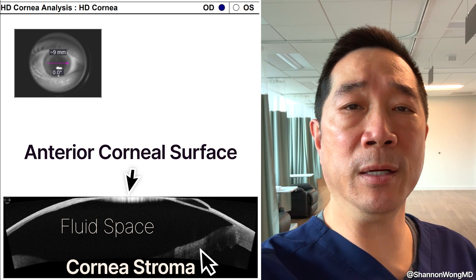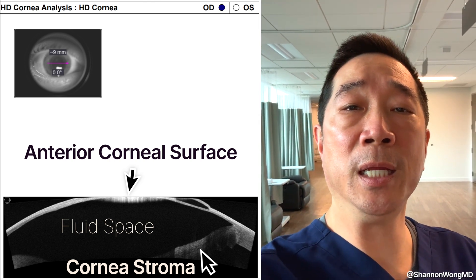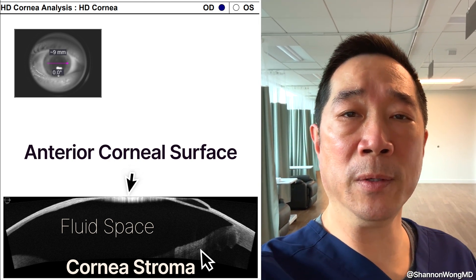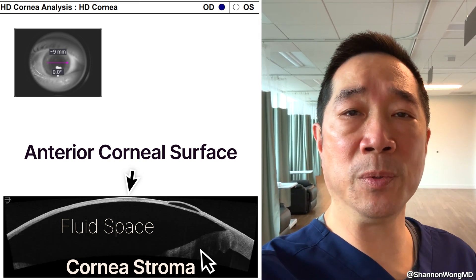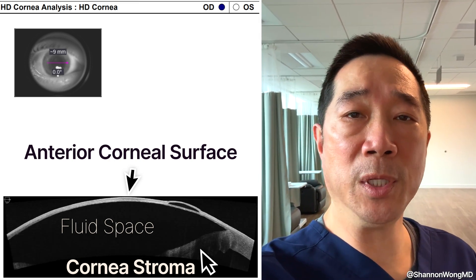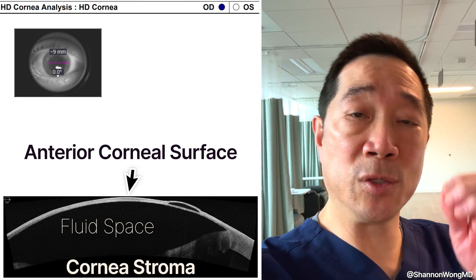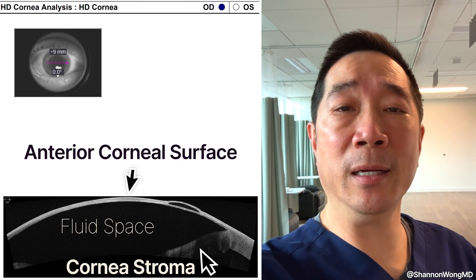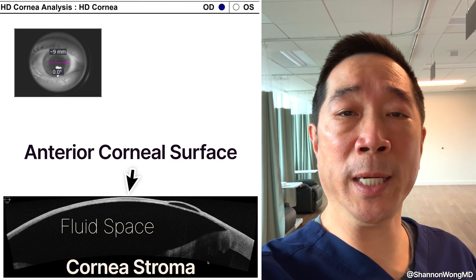Keep in mind, he has had prior LASIK. So I obtained an anterior segment OCT, and what we see is that the anterior curvature of the cornea is pretty normal, but you can see that there is a stromal bed that is posteriorly bowing.